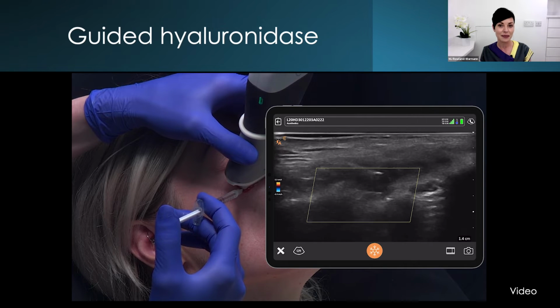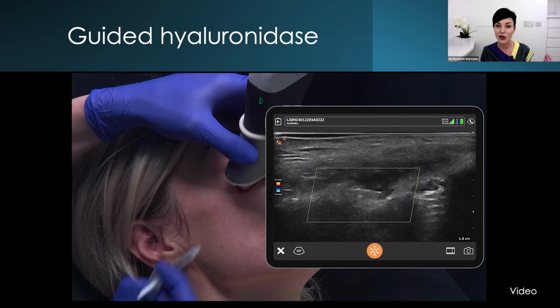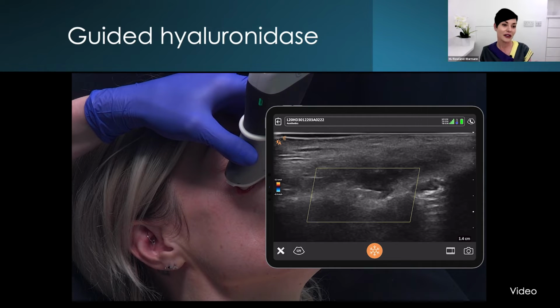units per deposit. I work with a 5 ml dilution on 1500 units for this. So 0.1 ml is 30 units. And I find that this is the ideal concentration for aesthetic correction.